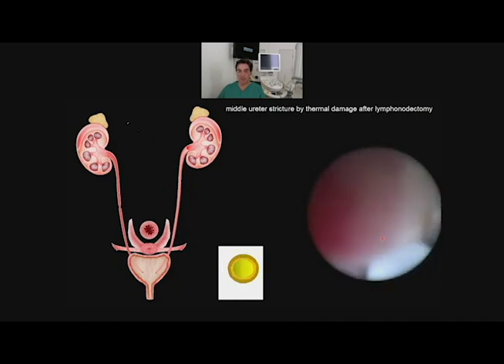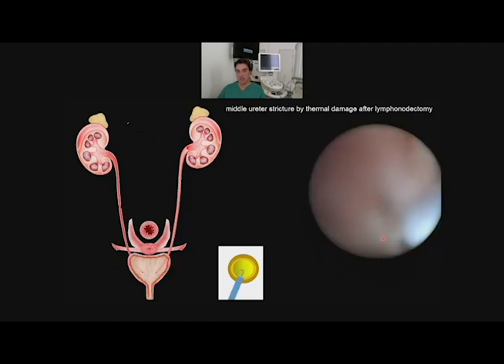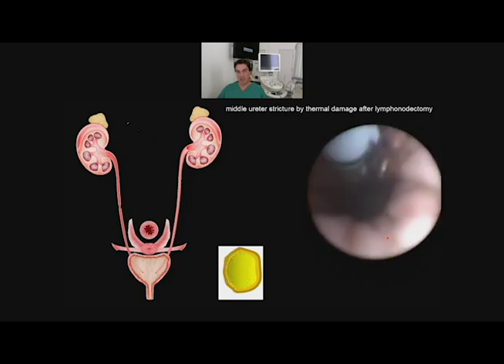But if you cut the stenosis with monopolar under vision, not with laser, because laser destroys more of the ureter, you can go only straight inside with the monopolar. You cut the stricture really, really exactly under vision. You have no problem. Also, if you're nearby the vessel, you have to check beforehand where the direction is. In these cases, I do not go near the iliac area. I go more at 9 o'clock. You see it now. I go through.